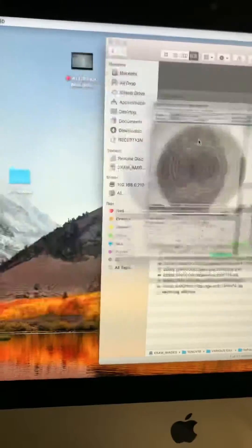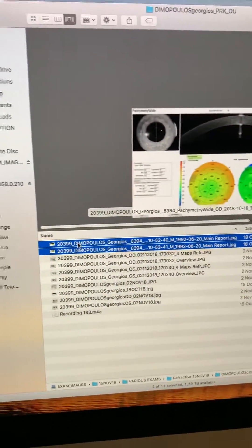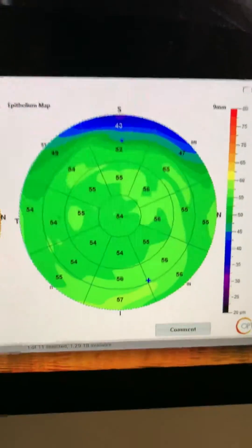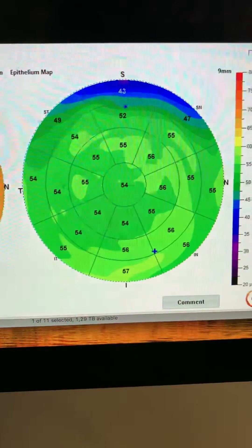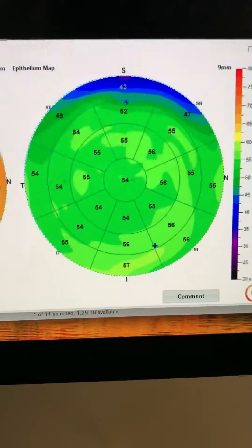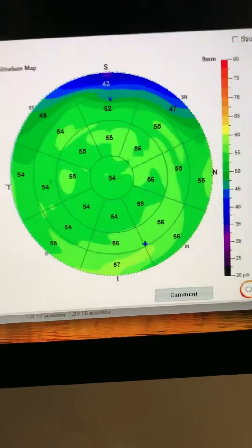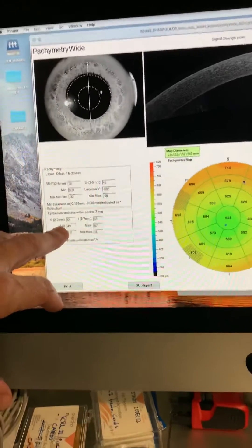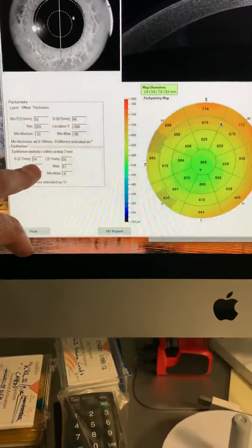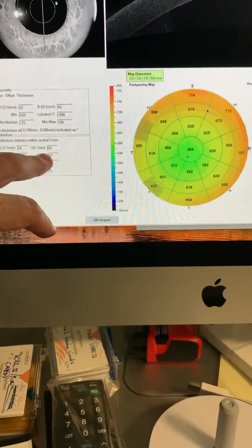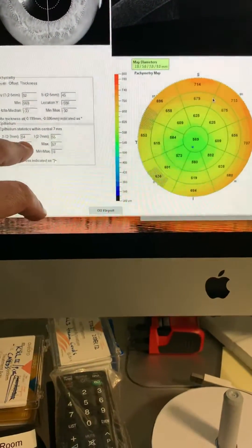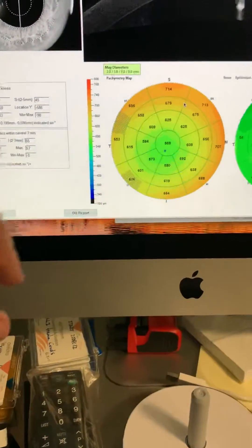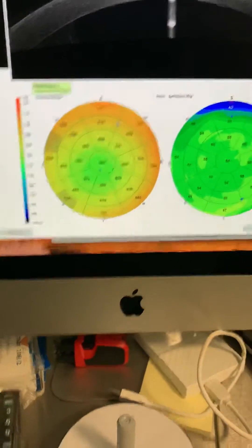Let's look at the epithelium. We can do Streamlight with topo-guided, so we're going to use the topo-guided lessons learned to treat this epithelium with Streamlight. The average epithelial thickness is 54 for the superior cornea, 55 for inferior, so we're going to go with an average of 55.